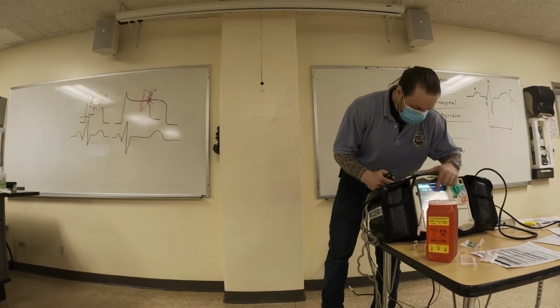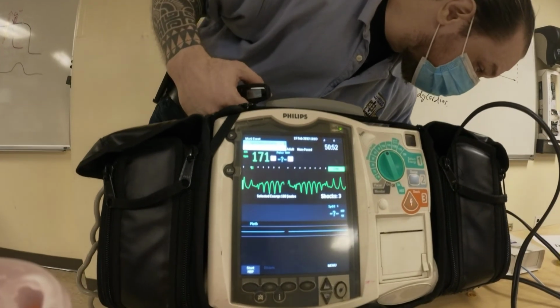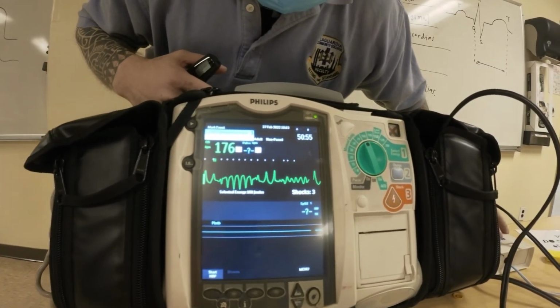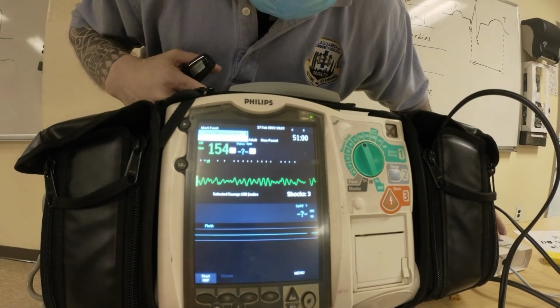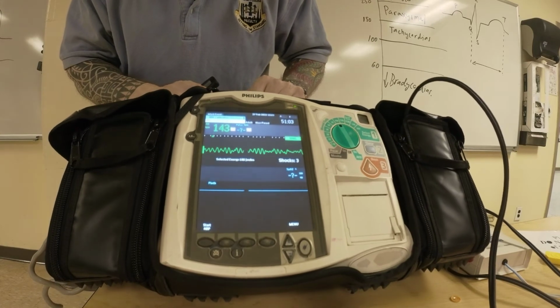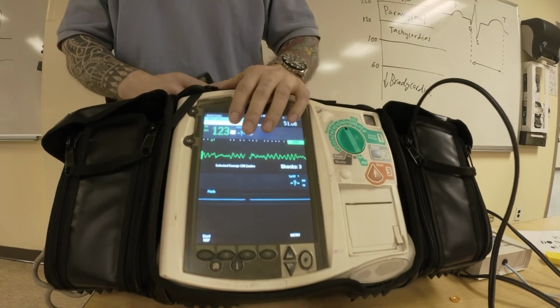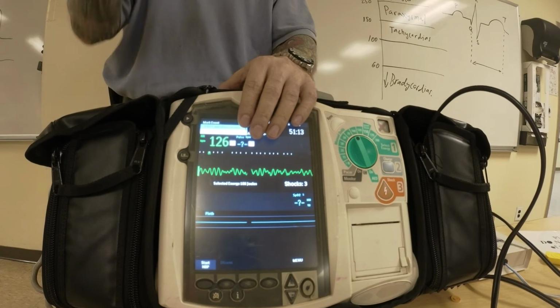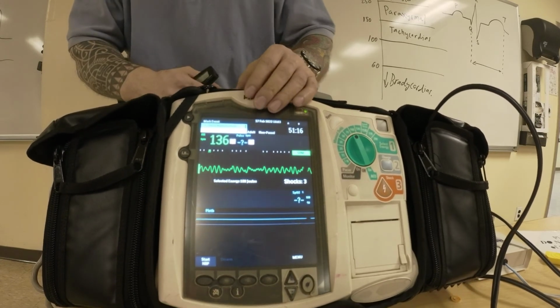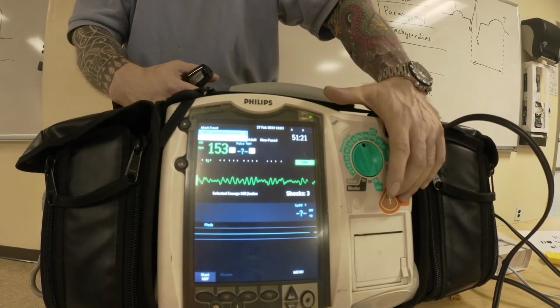What I'm saying to you is, this rhythm that this monitor shows is kind of regular, and it's even picking this up. Let me change it to VF for a second. If I change this rhythm to VF, it's not picking up all the complexes, and VF is irregular. So in torsades, you may have those paroxysms where the machine is not able to sense the R wave. It's charged up, and you're pressing this button, and it's not engaging, so you're standing there jamming it, right?